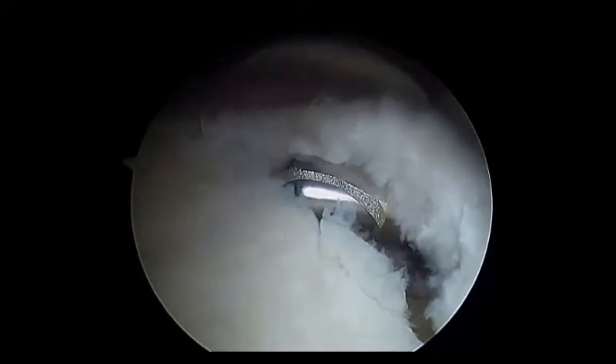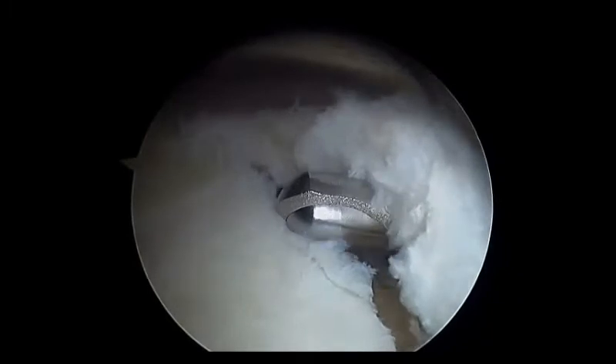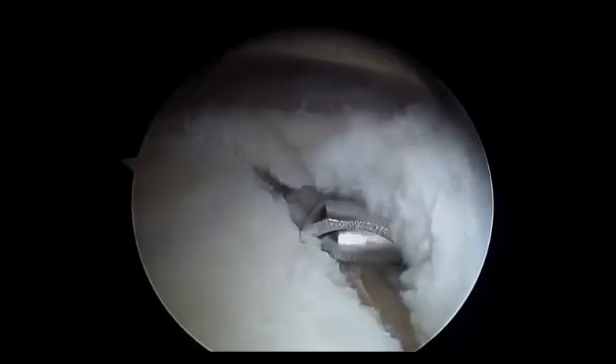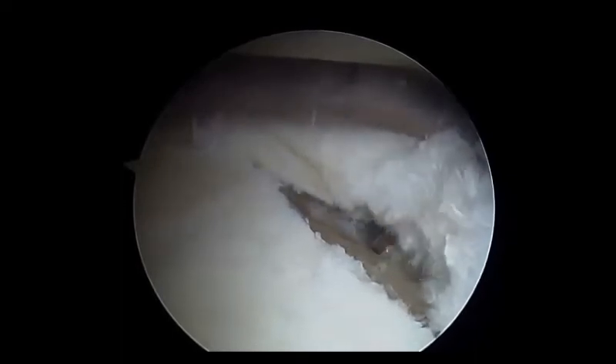Utilizing the SWAT portal, unwarranted resection of the labrum can be prevented. The glenoid rim is prepared. Thorough exposure of the bony surface is necessary to maximize soft tissue healing.